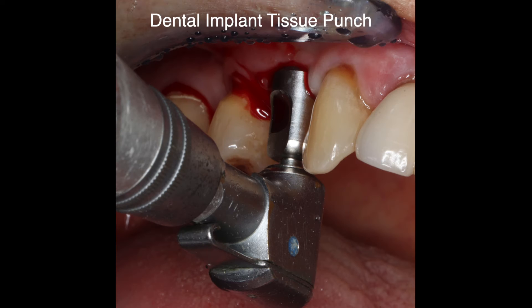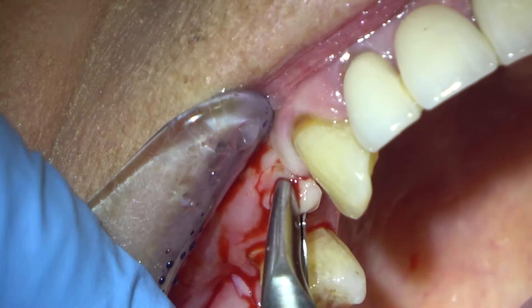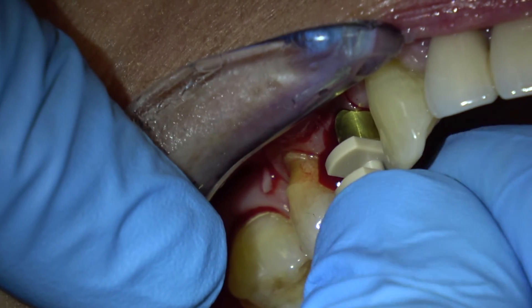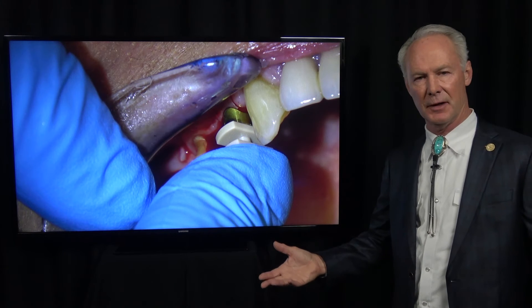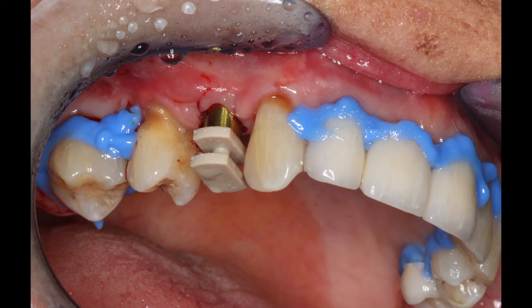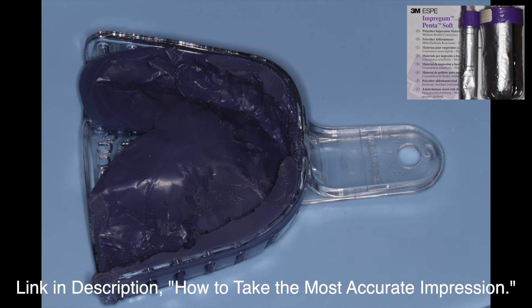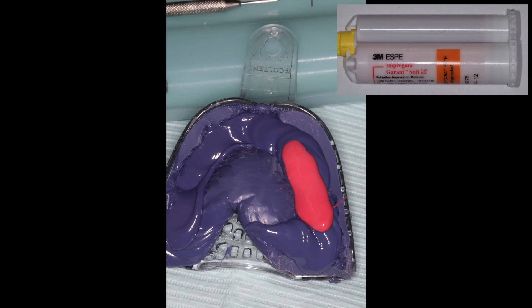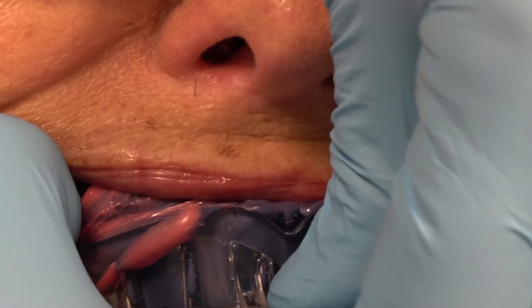I'm using a tissue punch to punch through the soft tissue, then these are rongeurs to remove that little core. Then I unscrew the healing cap and place a Bio Horizons closed tray impression coping. I really like the closed tray — it's easier than an open tray. You snap it into the implant, it has great undercuts, you know it's stable. Take a periapical radiograph to be sure it's seated completely. This is a custom tray polyether impression — wash material squirted directly onto the impression coping and into the tray. A very accurate impression.